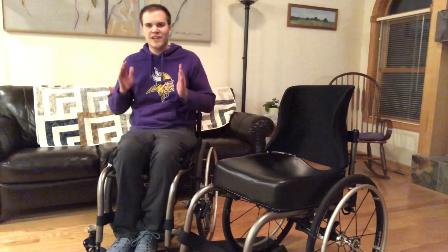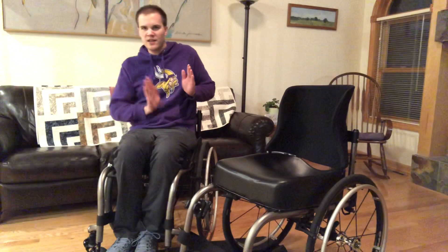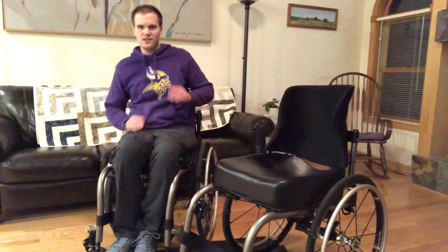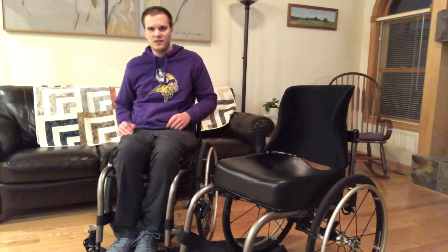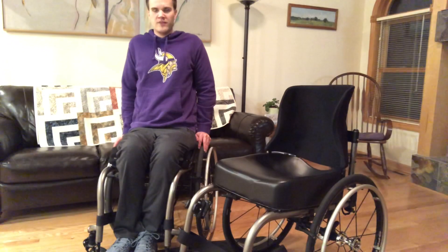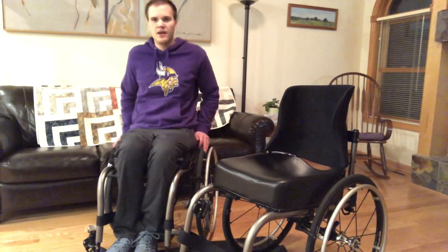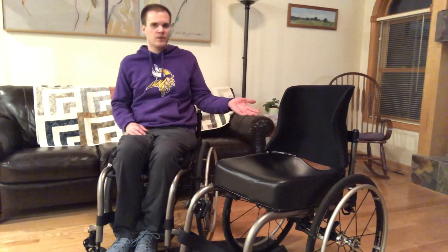So I naturally kind of slouch and my spine kind of curves like this — you can kind of see it probably. So if I were to lift myself up I'd be equal to this chair, but I don't have to lift myself up when I'm in this chair.